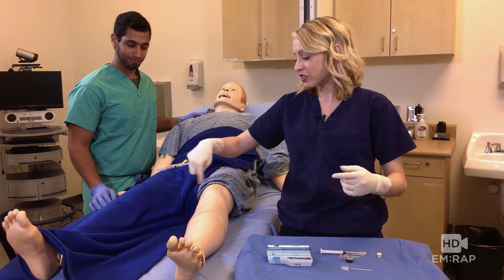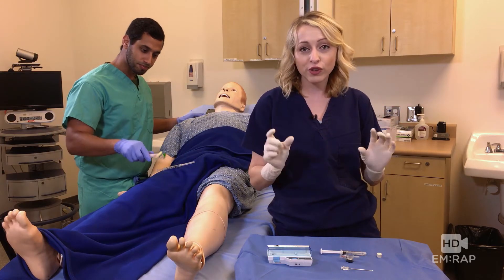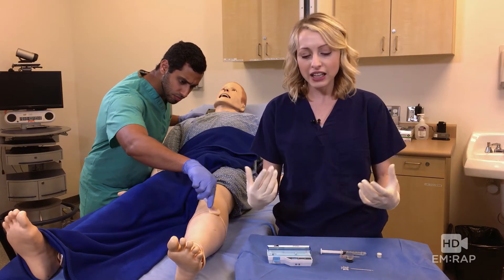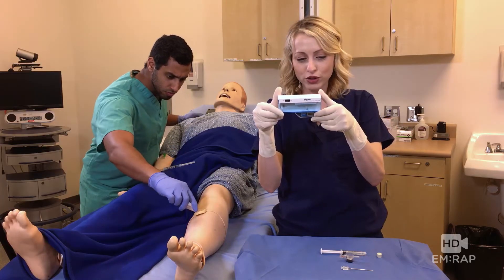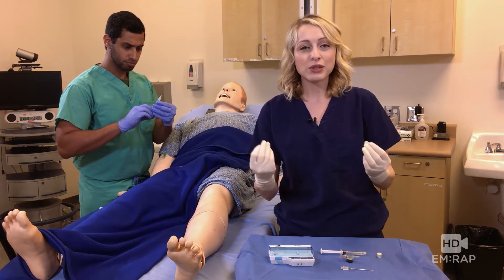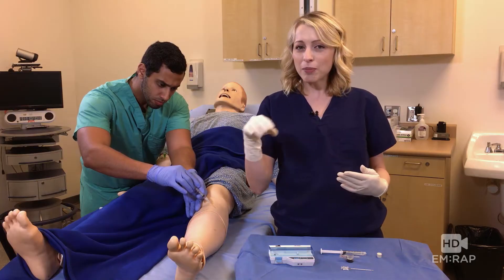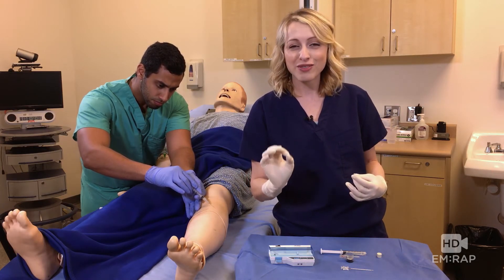Why don't you get that all sterile and anesthetized? Now we're going to do this in three parts. First, we are going to show you how to set up, calibrate, and use the STRIKER intracompartmental pressure monitor system. Then we're going to do a little bit of a review of the anatomic compartments and where to insert the needle for each compartment. And finally, we're just going to top it off with a little bit of rainbow sprinkles and do some pathophysiology right there at the end.